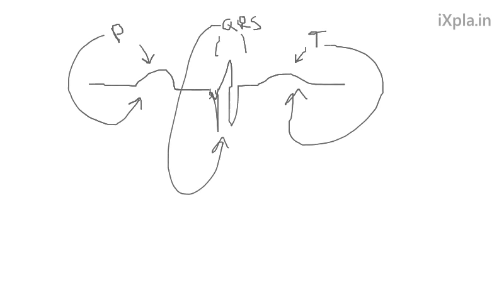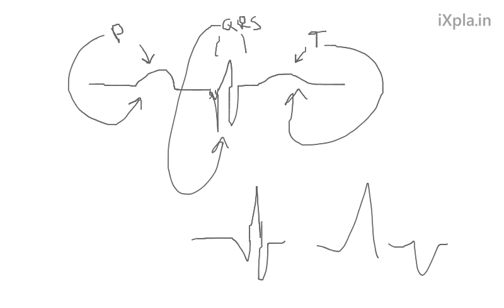Know how to name a QRS segment, like the first wave going up is the R wave, the first wave going down is the Q wave, then you got the R wave, and the S wave was the second wave going down. And how to name them if it's like this, or if it's like this, just look at the book for that. I don't know how it gets more simpler than that. There's a page in the book that defines what all these are. Like this is a QRS segment. This doesn't go down, so there's no Q, but we got the RS. This is named a little different. Don't quite know off the top of my head right now, I'll admit that. But look in the book, and the page defines all those things. And if that is a picture, that could be a multiple choice, or it can show you a picture of it. It can be either or.